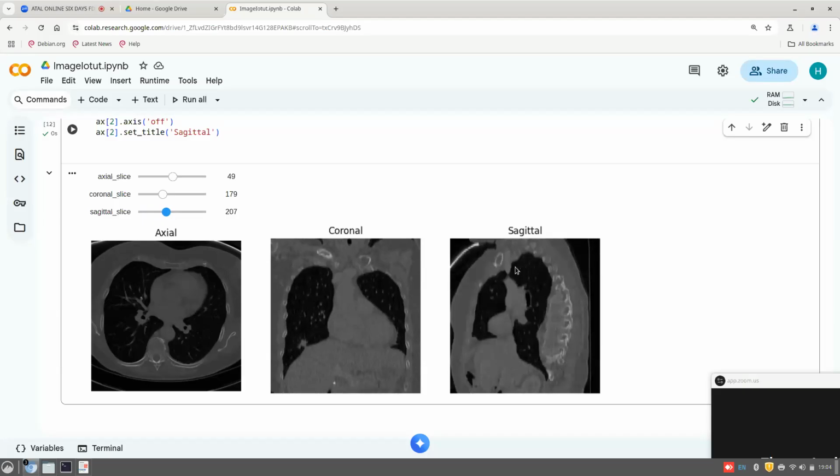So the idea I want to convey is that AI has to detect not only in one image. If it is a 3D image like a CT scan or MRI, both are 3D images, you have to detect the diseases not only in one image but also along all these slices to tell whether a person is normal or abnormal.